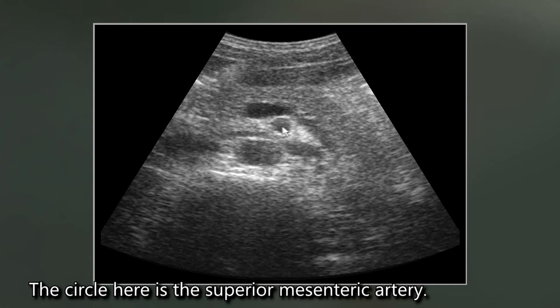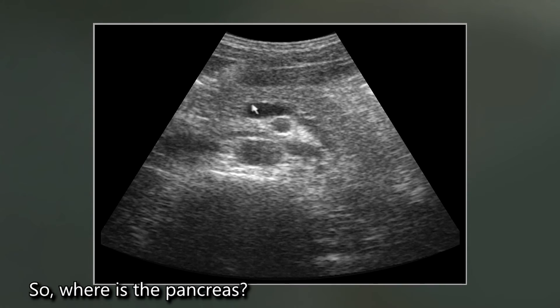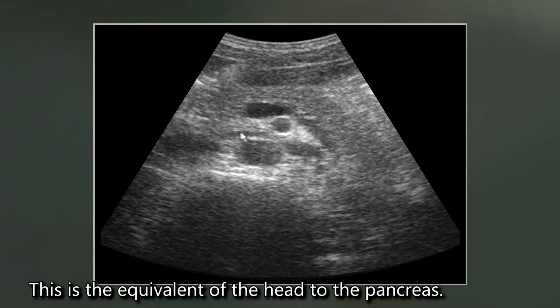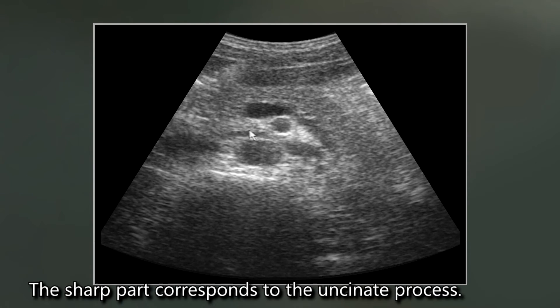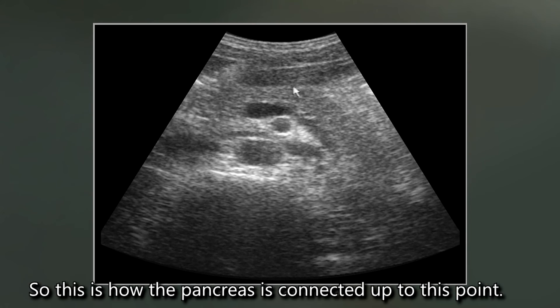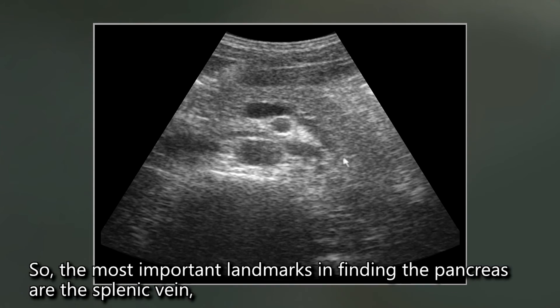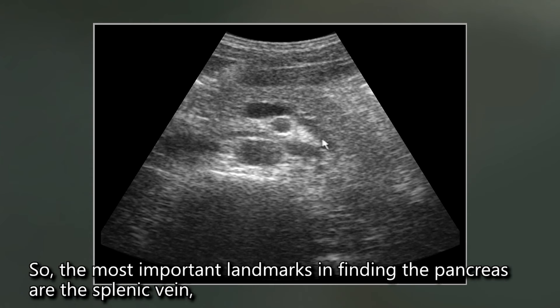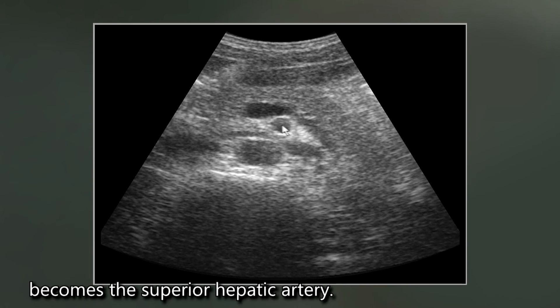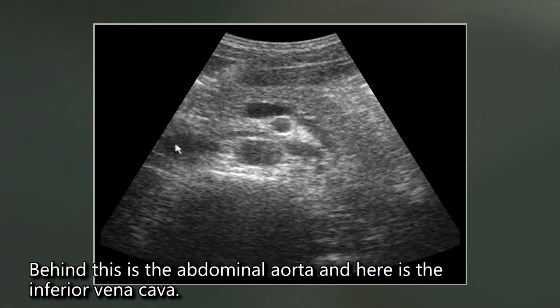The circle here is the superior mesenteric artery. So, where is the pancreas? Here is the front soft tissue — this corresponds to the head of the pancreas. The sharp part corresponds to the uncinate process, and this is how the pancreas is connected up to this point. The most important landmarks in finding the pancreas are the splenic vein, superior mesenteric artery, and behind it the abdominal aorta. Here is the inferior vena cava.